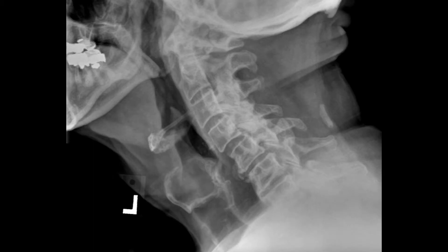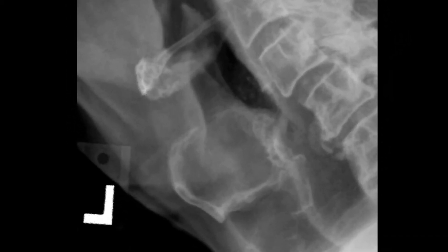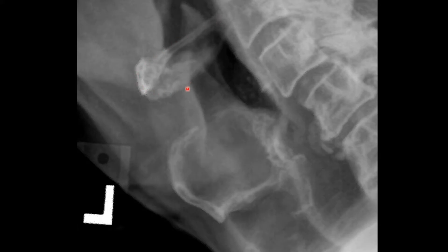Let's take a look at a lateral cervical view. You'll notice anterior to the cervical spine a large calcification. This large density represents the thyroid or laryngeal cartilage calcification — this is normal physiologic calcification and does not represent pathology. Superior to that we have the hyoid bone. The laryngeal or thyroid cartilage calcification can look very aggressive, very large, very calcific, just like a mass, but this is not pathology.